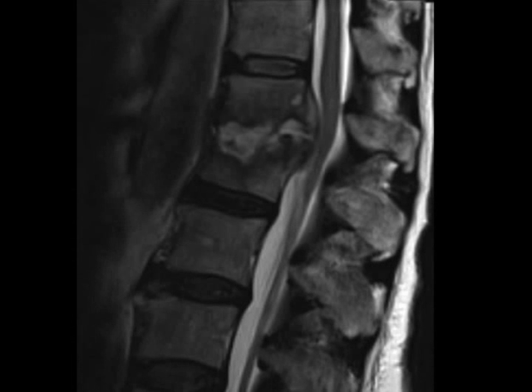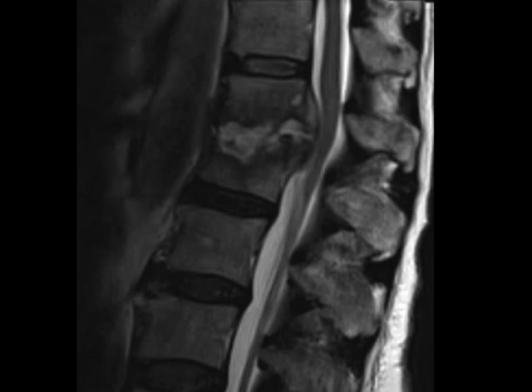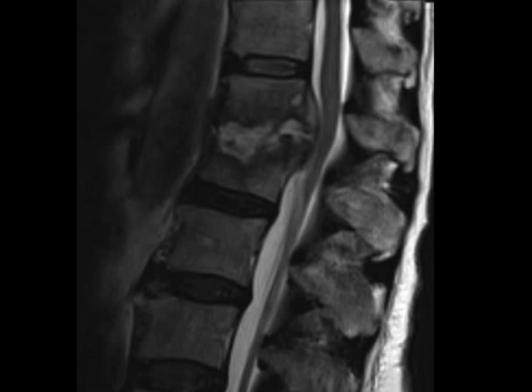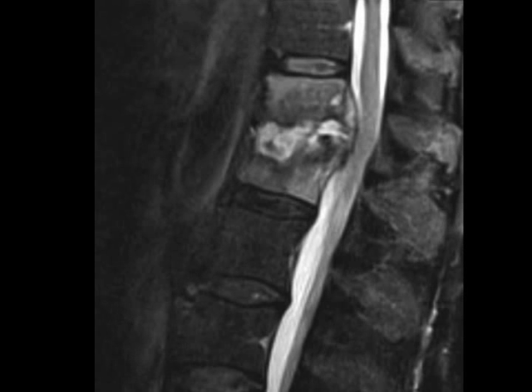On T2 and STIR sequence images, we better define the site of discitis osteomyelitis with extensive edema within the vertebral bodies and fragmentation of the posterior superior aspect of the L1 vertebral body with retropulsion of bone fragments.